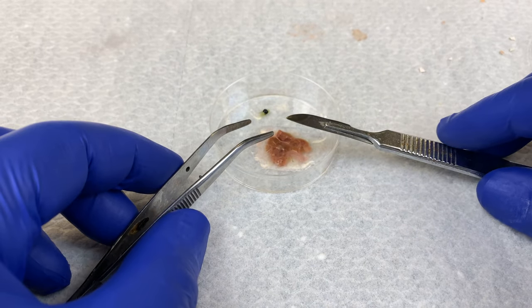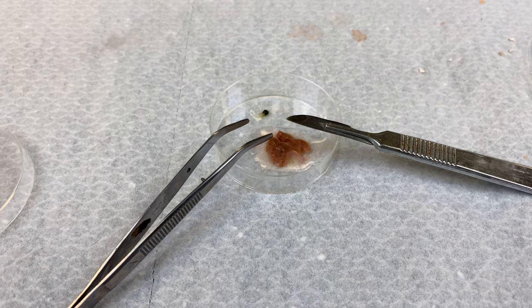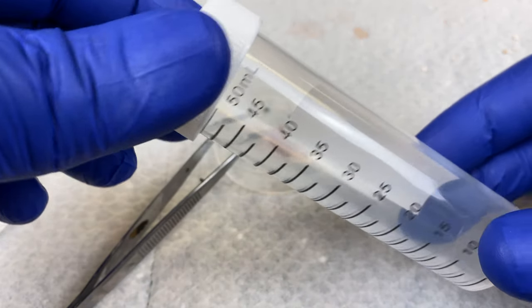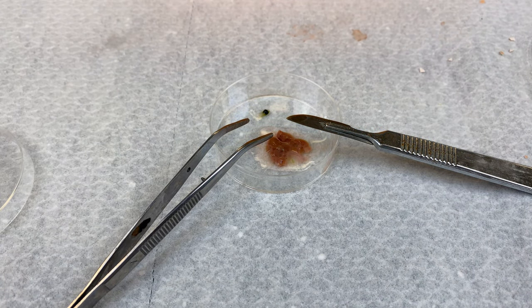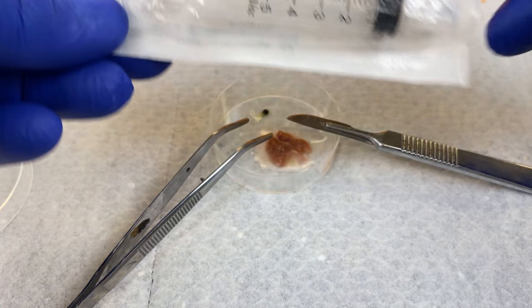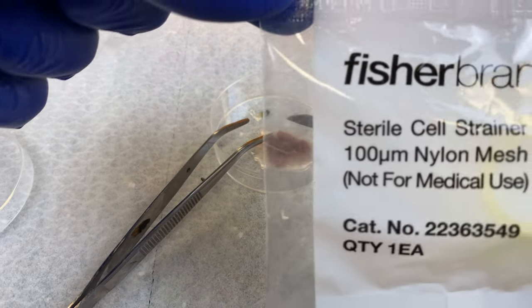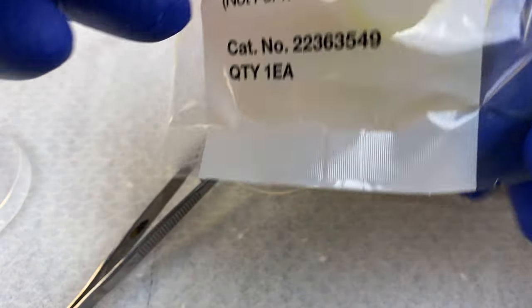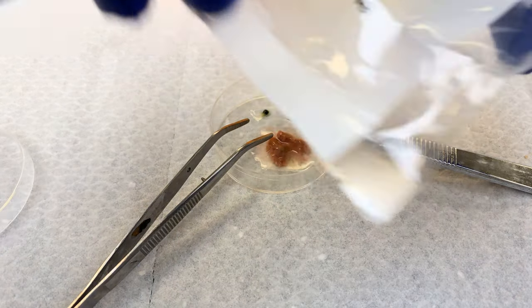Using sterile forceps and a scalpel blade, I will cut up the liver into small chunks. I will get a 50-mil conical tube. I need to obtain a 5-mil sterile syringe. And I would like to get a 100-micrometer nylon mesh — this is our cell strainer. This can fit in the top of our 50-mil conical tube.